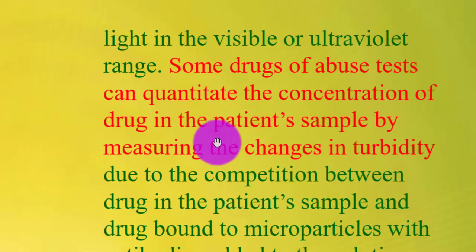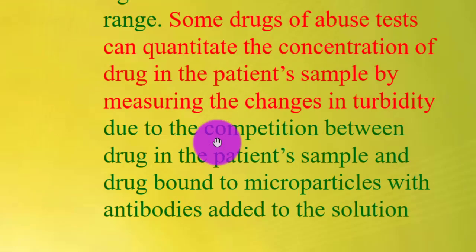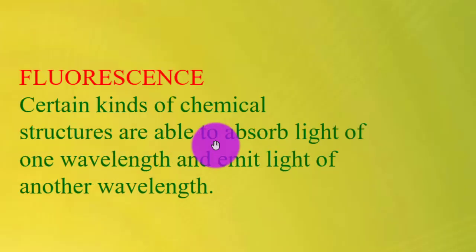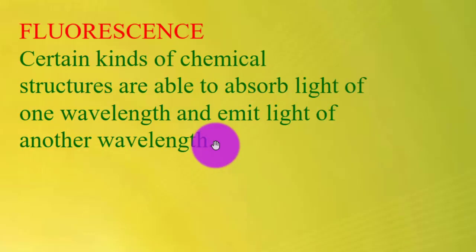Some drugs of abuse tests can quantitate the concentration of drug in the patient sample by measuring the change in turbidity due to competition between drug in the patient sample and drug bound to microparticles with antibody added to the solution.